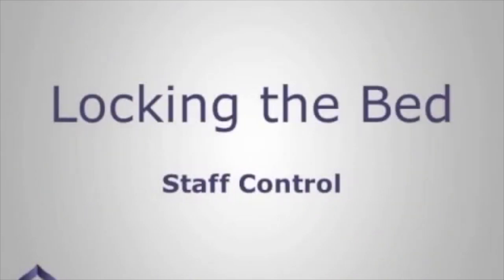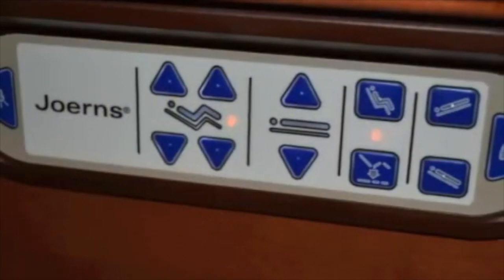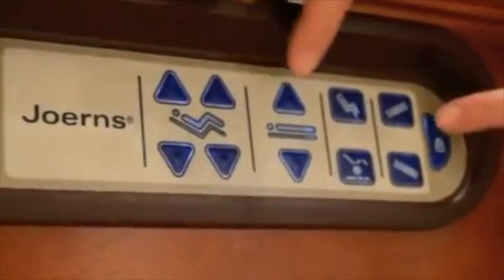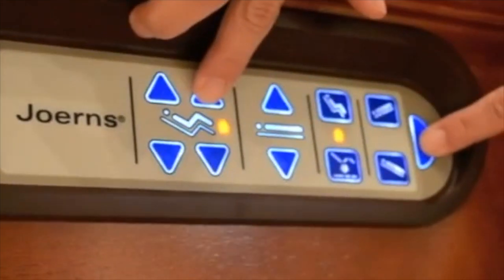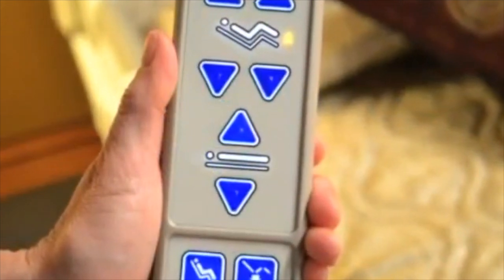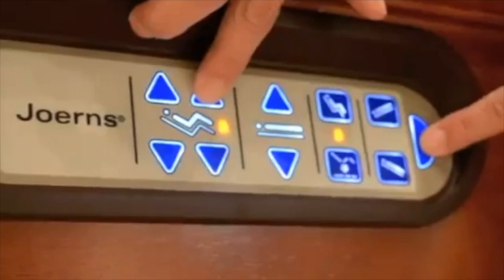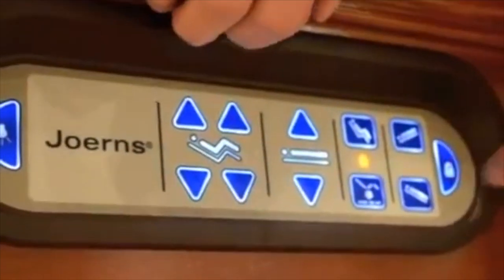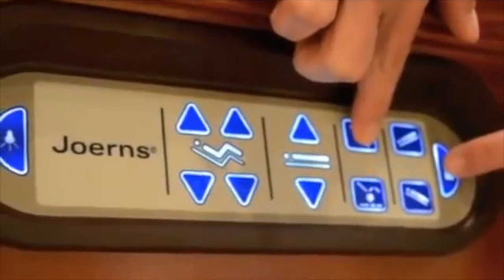Individual functions can be locked out using the staff control. If the caregiver needs to prevent the resident from raising the knee section, then they would simply press the lock button and up arrow for the knees at the same time. An amber light will appear showing what functions have been locked out. To unlock the function, press and hold the lock graphic on the panel and push the function you wish to unlock.